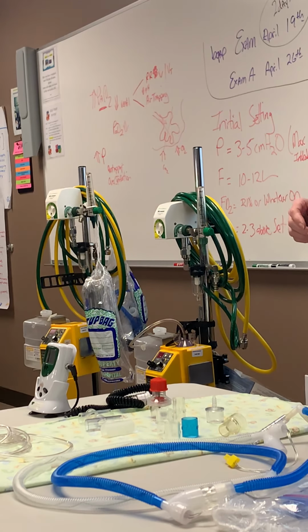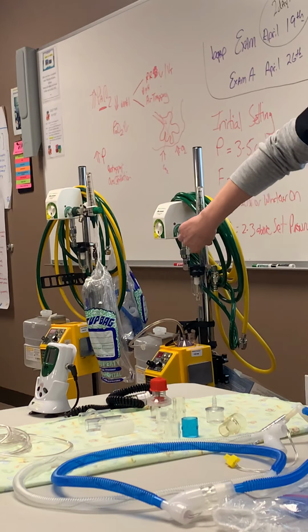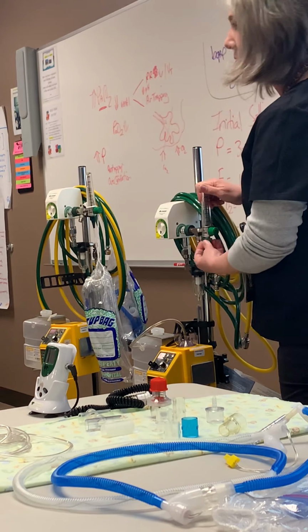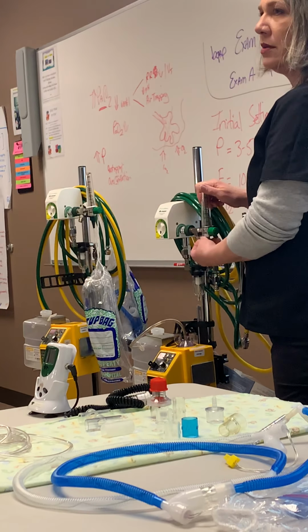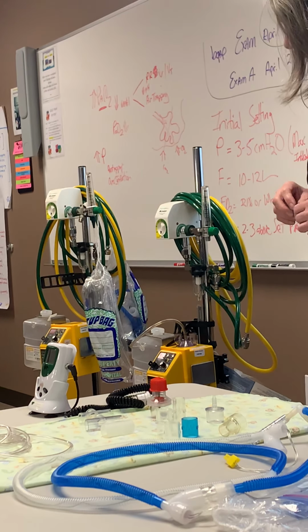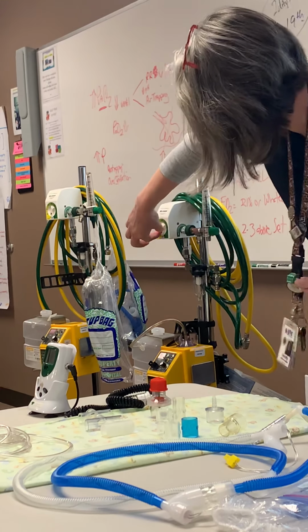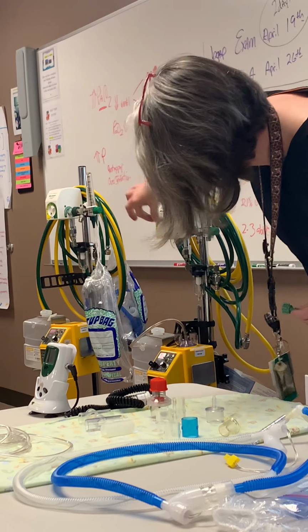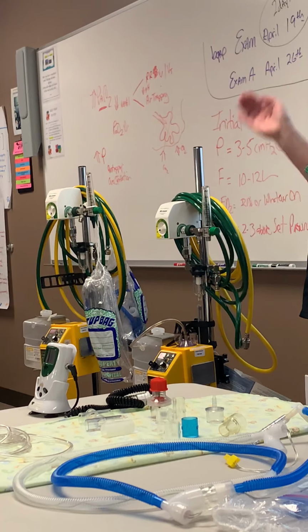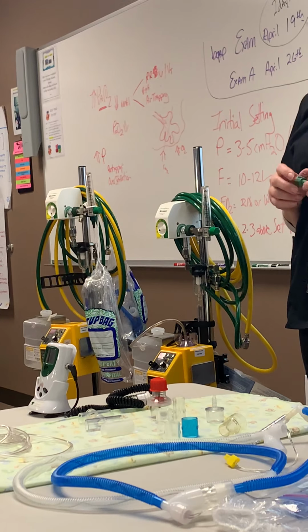All right. What's D? D is the flow meter. So flow meters. Hopefully by now all of you know what a flow meter is. Now, quick question. Fu, this is not me picking on you, but I want to ask you a question. If I have FiO2 set here at 30, okay? I'm going to put on 30. There's 30 right there. And I have flow set at 15, or flush. How much oxygen am I delivering my baby? 30.